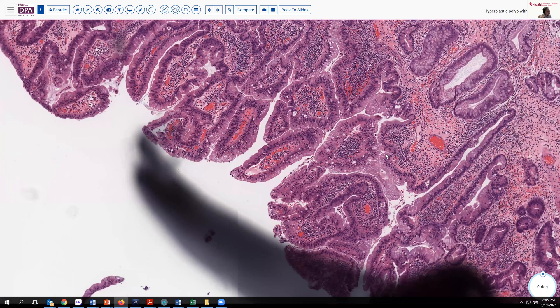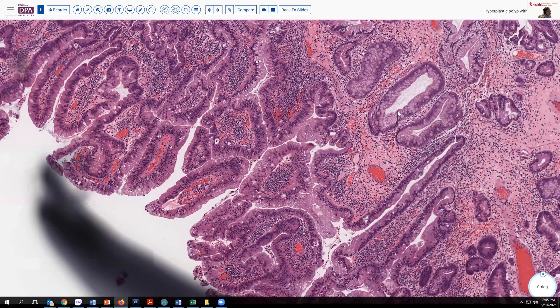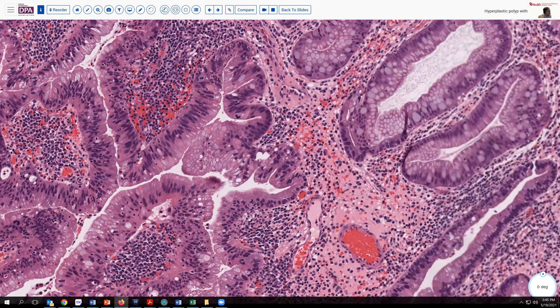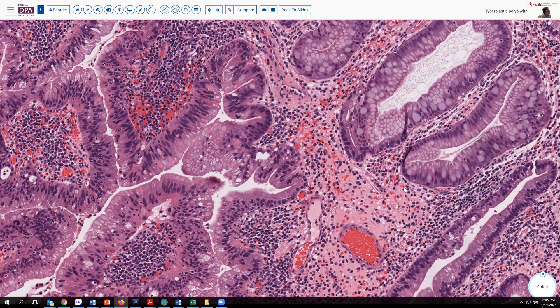We begin to get a little bit of a suggestion of blue goblet cell type differentiation. Sometimes the setting for these polyps is atrophic chronic gastritis, so that's a consideration in terms of the background.